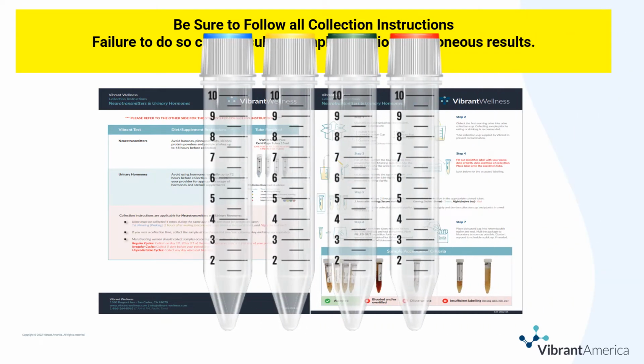The color-coded tubes look like this. Blue is for the waking sample, yellow for 2 hours after waking, green for the evening before dinner, and red for at night before bed.